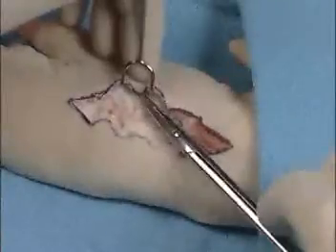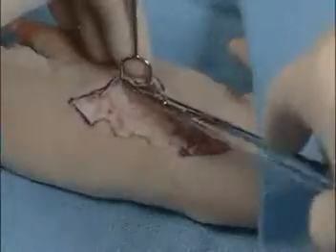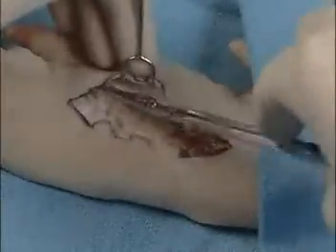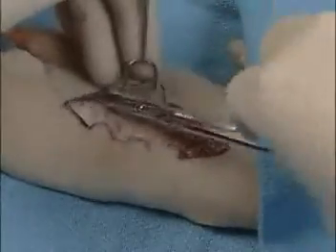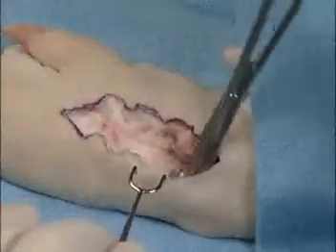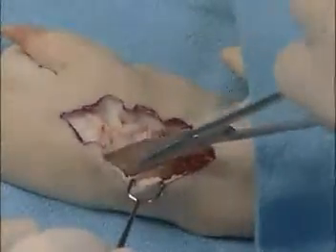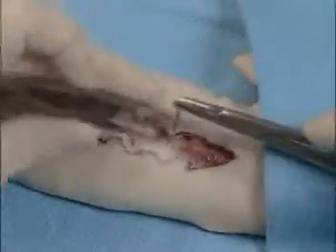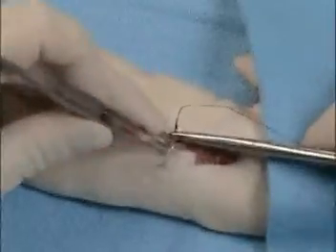Note the double hook, and the third instrument, as it were, is the middle finger of the surgeon's left hand, while the scissors are dissecting using the tip upward technique so as not to cut any of the important deep structures. Once these tissues are well mobilized, then the surgeon will try to close the tissue by pushing the tissue together. Deep sutures can be utilized if necessary.